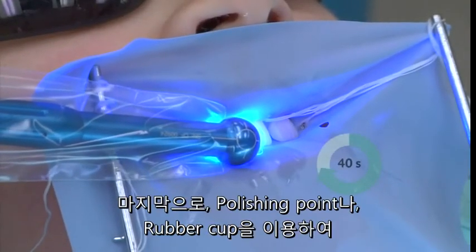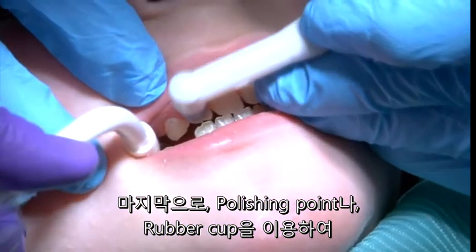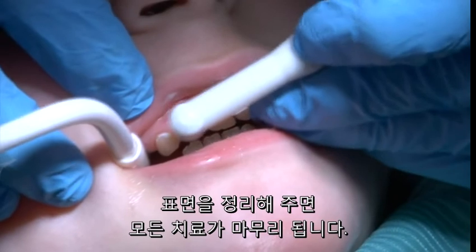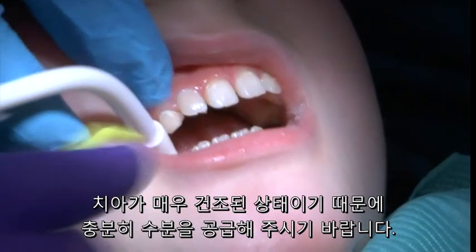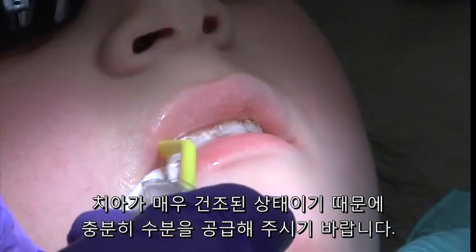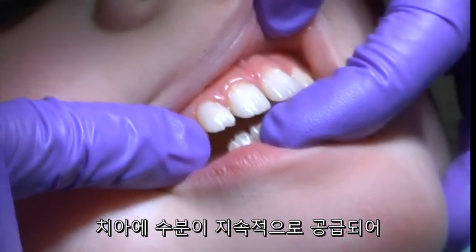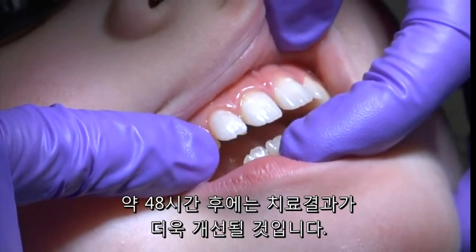The treatment is concluded by lightly polishing the treated surface with a fine grit polishing point or a rubber cup. Since the tooth is quite dehydrated, it is recommended to thoroughly rinse with water. Results will continue to improve for up to 48 hours as the tooth continues to hydrate.